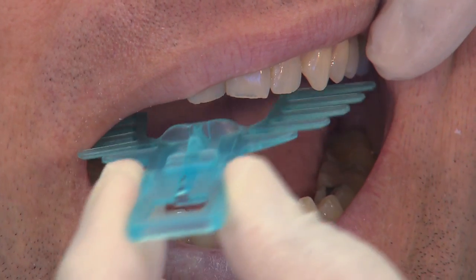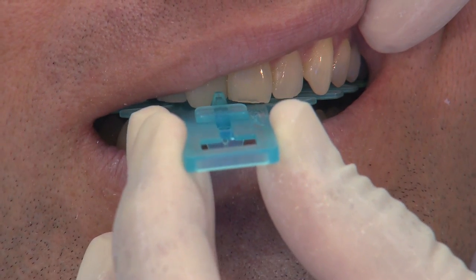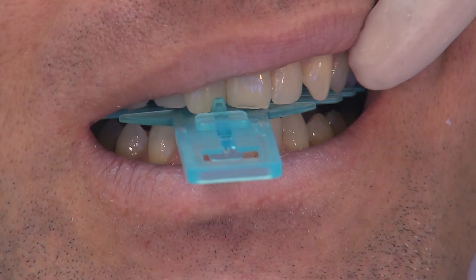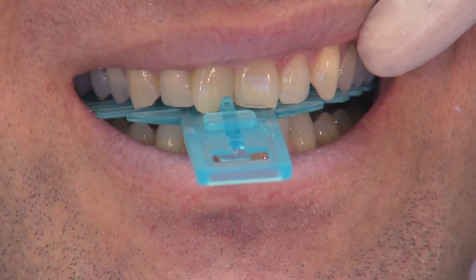So the next thing we want to do is use the protrusion gauge. And here we're going to use it to see where the patient's bite is in CR. So we have the patient practice biting down in their normal bite a couple times, and then we put the protrusion gauge in and have the patient bite down in their normal bite.